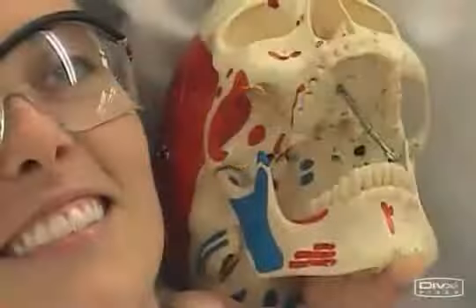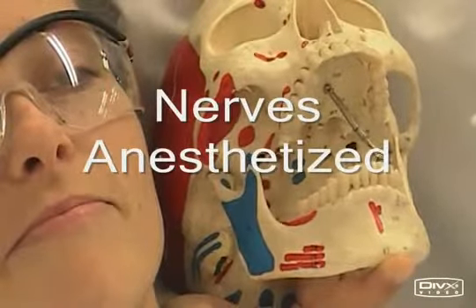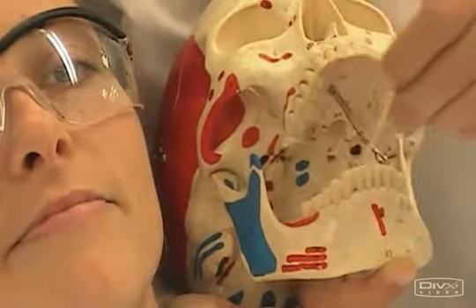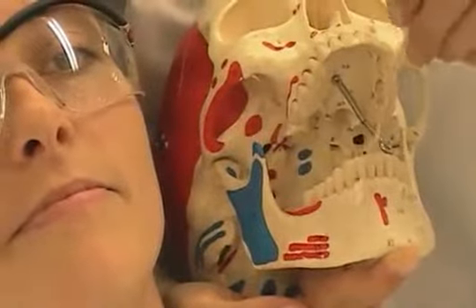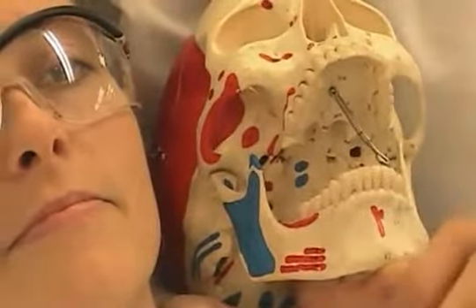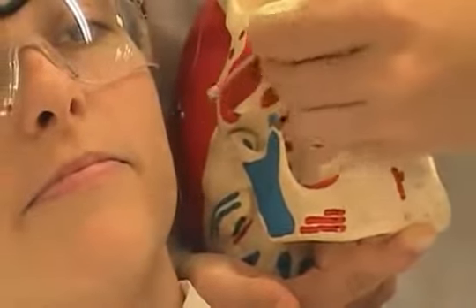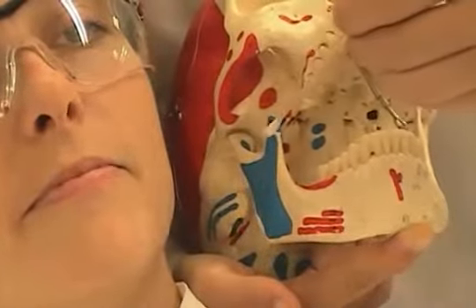Today we're doing the Gow Gates nerve block technique. The nerves anesthetized are the inferior alveolar, mental, incisive, lingual, mylohyoid, auriculotemporal, and the buccal in 75% of patients.